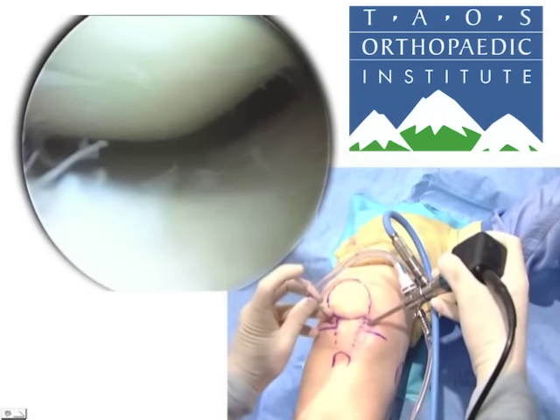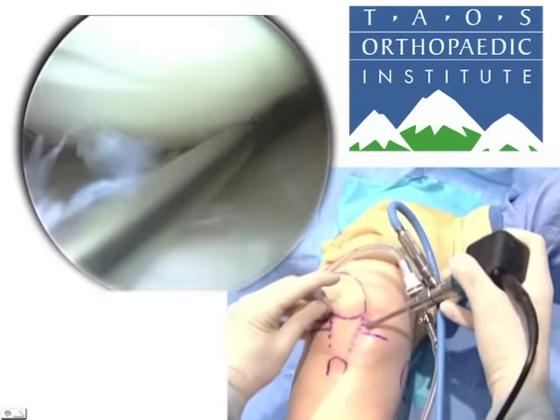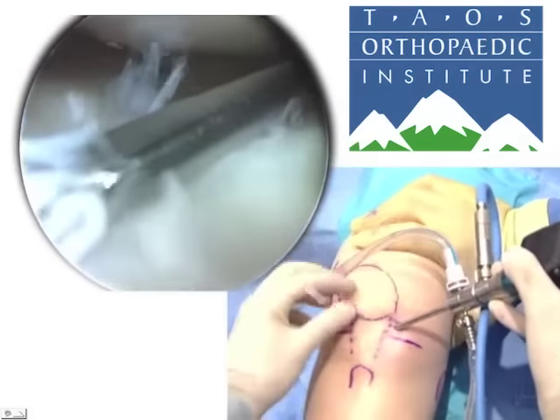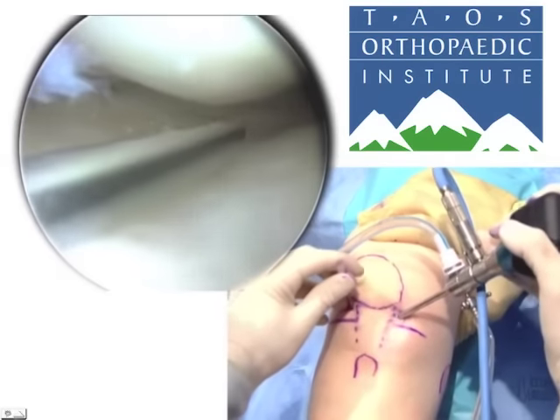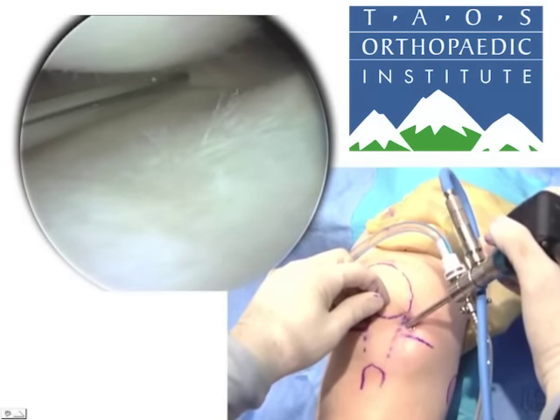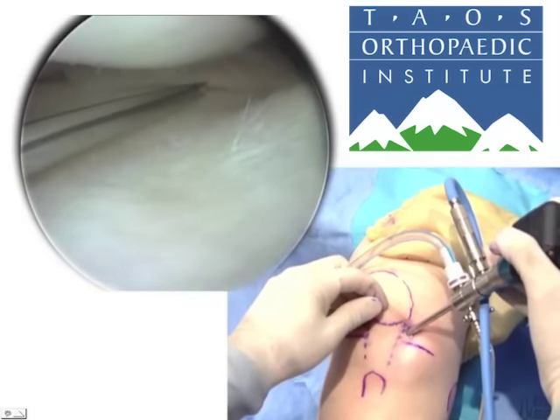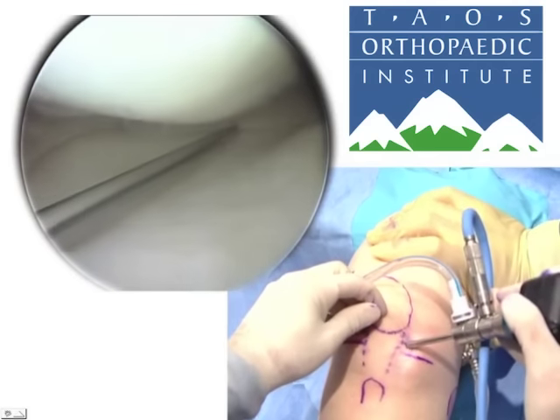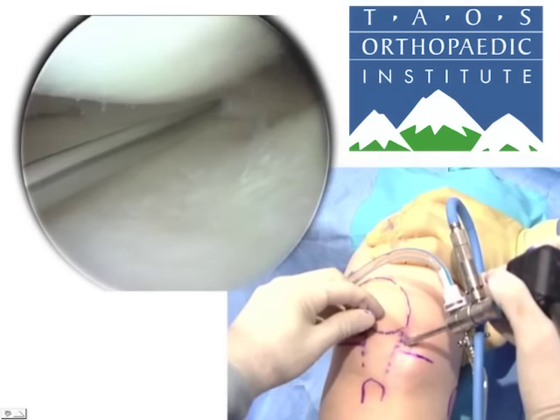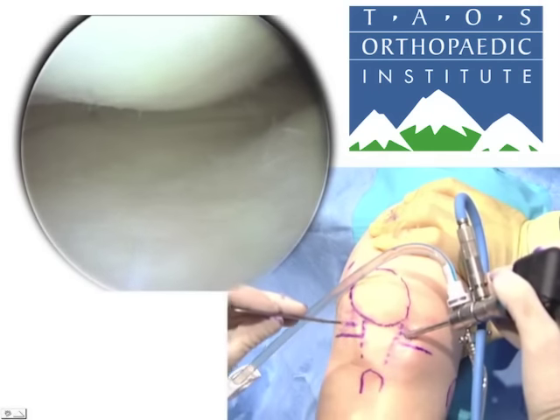I'll hold it toward the tip so I don't plunge, then, trying not to damage the cartilage, I will come in with the needle just above the meniscus — any lower would cut it. I have to be sure I can get to the posterior horn of the medial meniscus, because if we come in too high or too vertical, the femur will prevent us from getting all the way to the back.